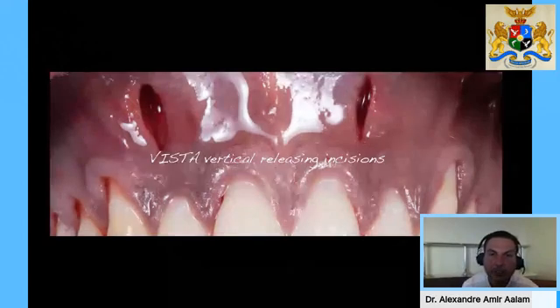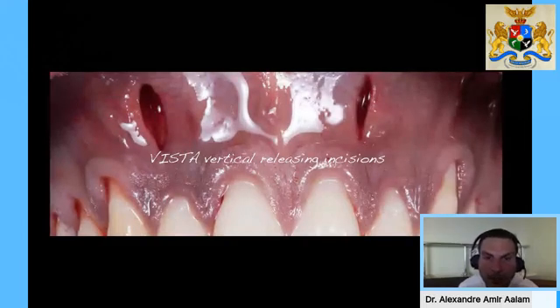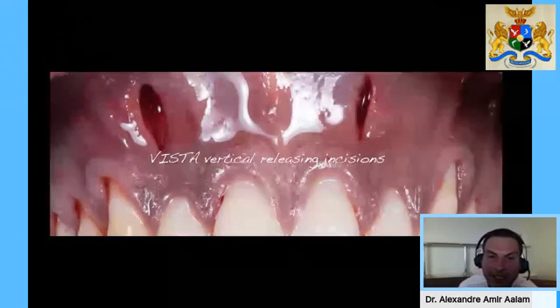And one of the major breakthroughs that we had in this surgical technique is the utilization of the Vista vertical incision technique that my good friend Dr. Homazadeh, that I taught with at USC, proposed a couple of years ago, and I believe that he's going to be one of your guest speakers in your webinars very soon.